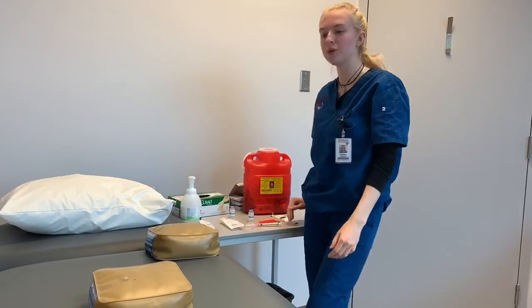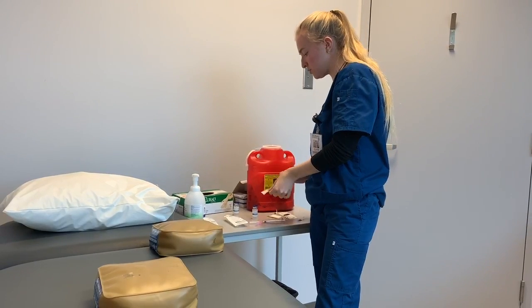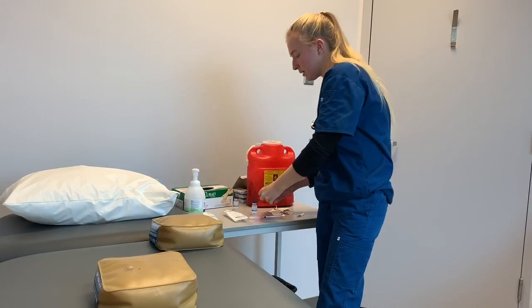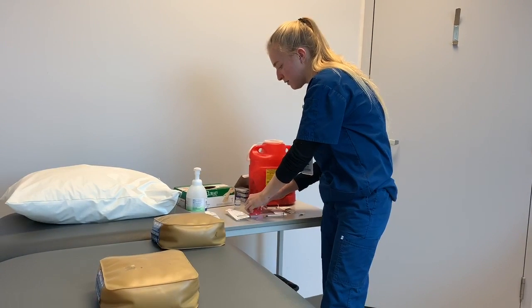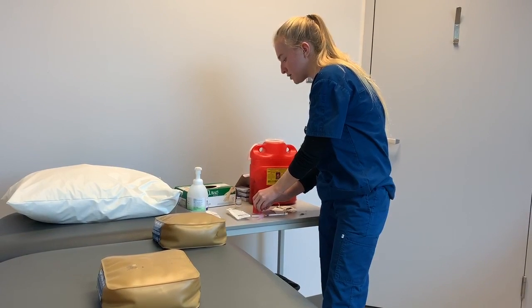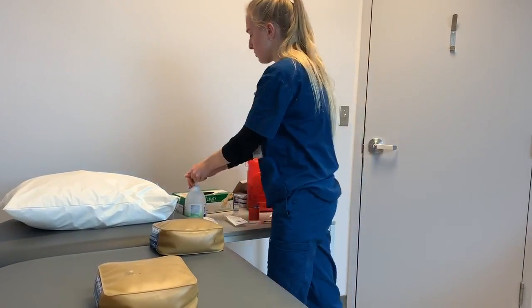Okay, so before doing my intramuscular injection, I'm just going to label the vial used for Mr. Mancini's heparin injection. So I'm going to label it with the correct name of the patient, so Mr. Mancini, and the time, so that the nurse after me knows when it was given and knows when to give it next. Okay, so I'm just going to perform hand hygiene.